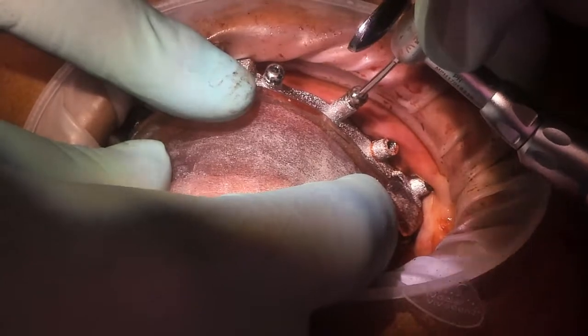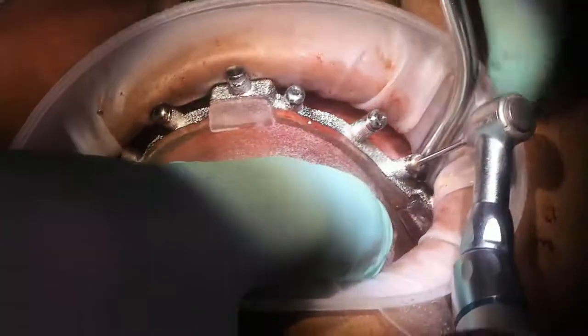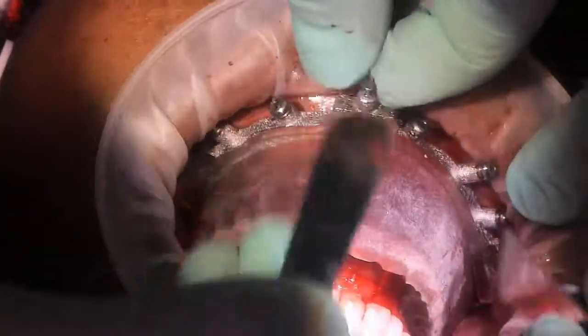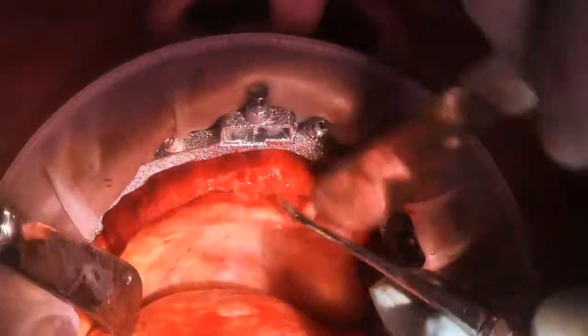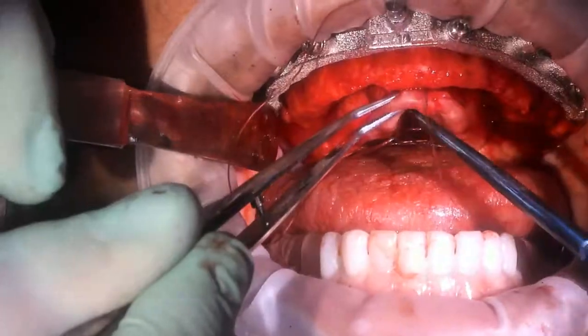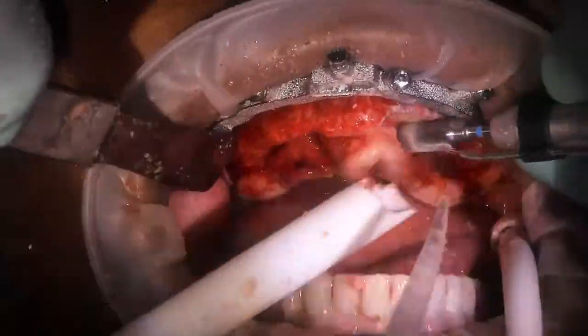We've heard issues over the years that if the sites are already drilled and then the fixation base and pin guide are removed, it could be difficult to find the holes again when inserting the fixation base later in the day when performing the other arch. However, the amount of accuracy that is gained when you have both pin guides in is probably worth searching for the holes. Once the fixation base is seated, the rest of the chrome surgery follows all other chrome surgical protocols, which is to reduce the bone to the level of the fixation base. Many doctors also tie off the lingual tissue with a suture and then perform all the bone reduction.